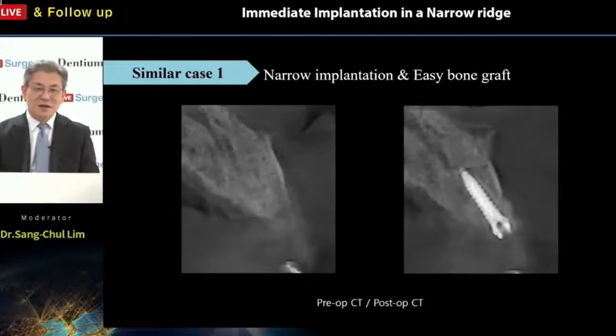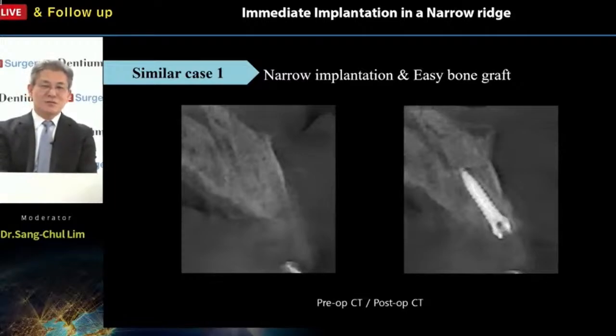It means the recognition and this information is very important. When you have implantation, as you know, stress on the bone crest area sometimes means resorption of crestal bone or some recession of soft tissues after final restoration delivery, right? However, engaging only the cancellous bone and keeping the crestal bone free of stress means a better result for long-term follow-up.